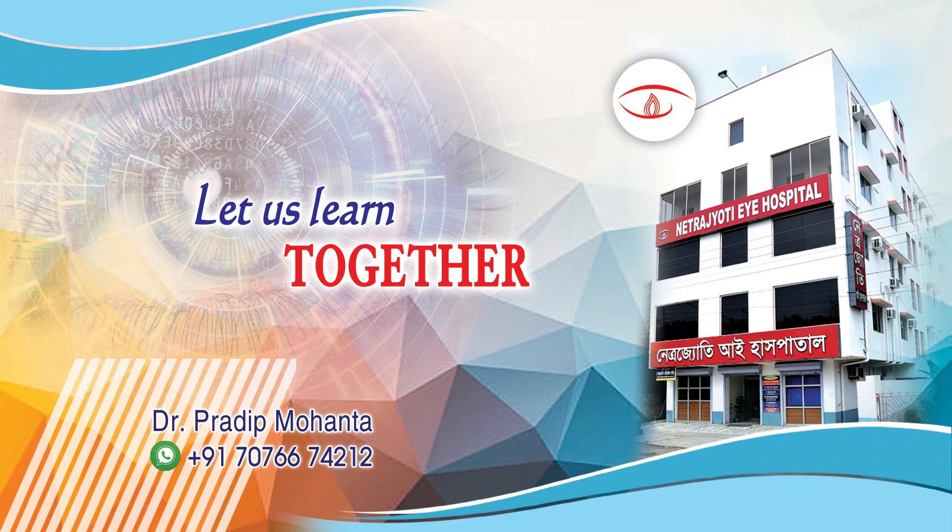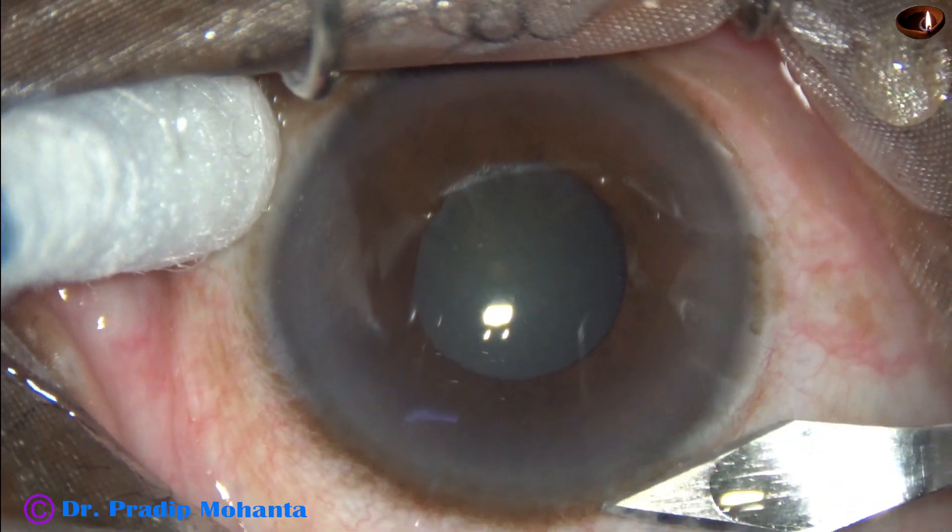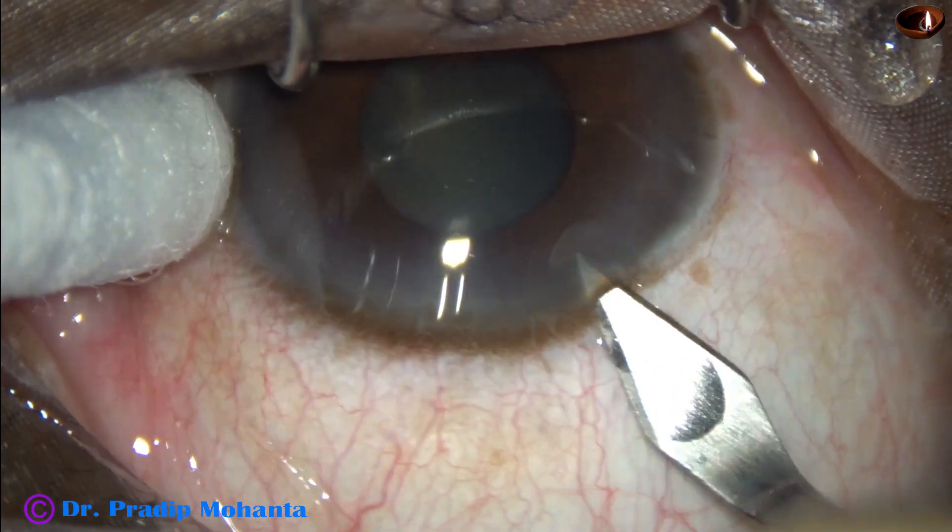Friends, welcome to my workpiece for hands-on phaco and SICS training. This is a soft cataract with small pupil. Let us observe this surgery.